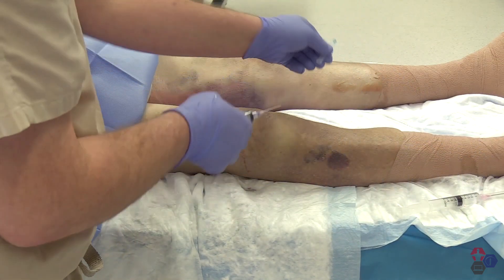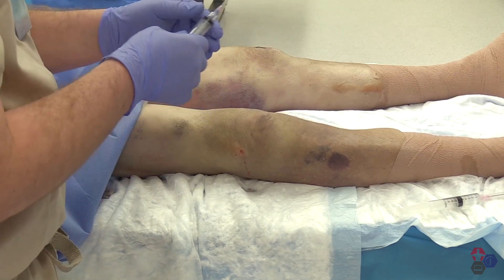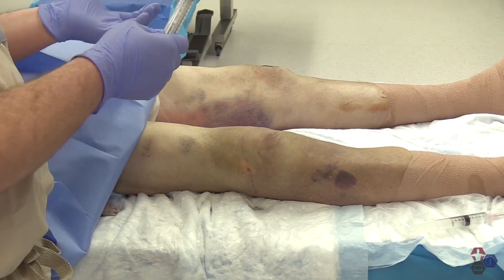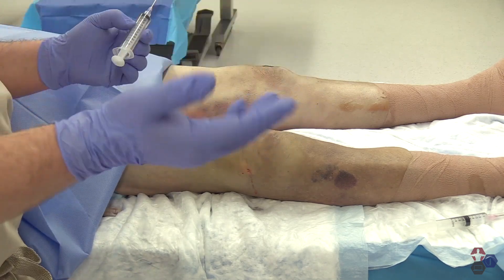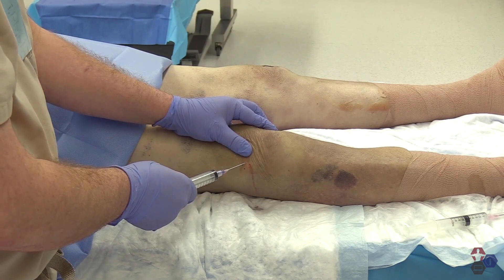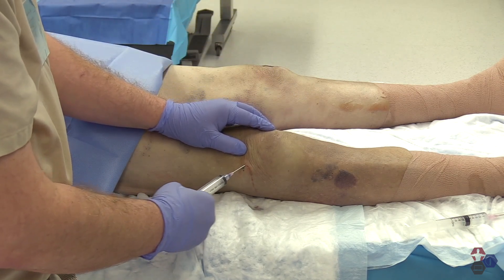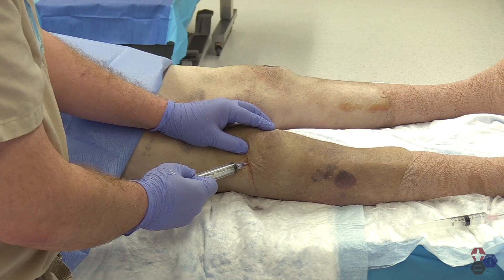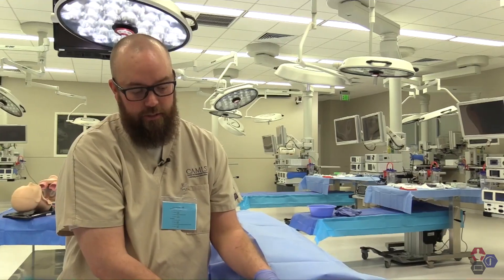Anesthesia is done and now we're ready for the actual procedure. An 18-gauge needle is ideal because the fluid itself can be very thick. Use an empty syringe — if you're expecting a large effusion, you can use a syringe with a volume much larger than 10 cc, up to 60 cc. At the same spot where you injected the anesthesia, aim for the underside of the patella into the joint capsule itself, then apply traction back on the plunger and you should get fluid.